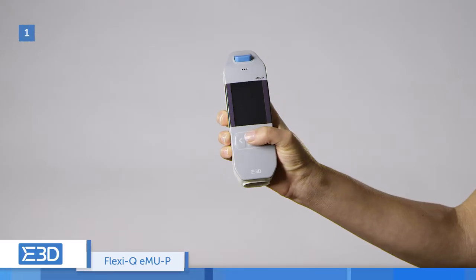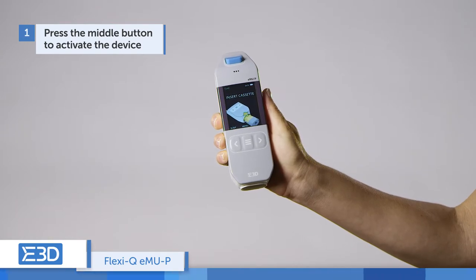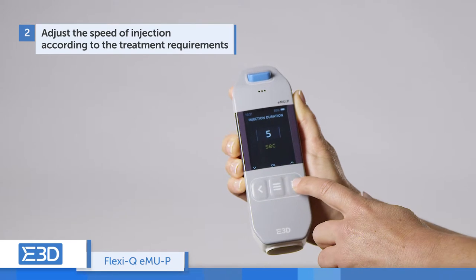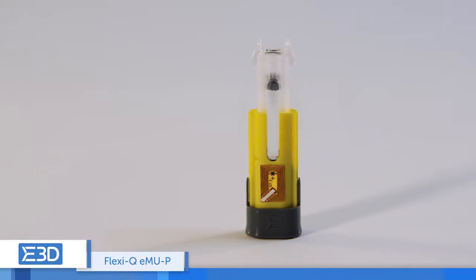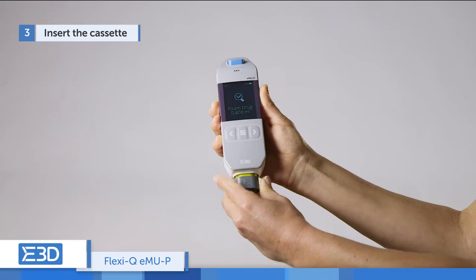Press the middle button to activate the device. Online instructions are displayed throughout the process. Adjust the speed of injection according to the treatment requirements. The disposable cassette is supplied with an integrated pre-filled syringe — simply insert the disposable cassette into the device.